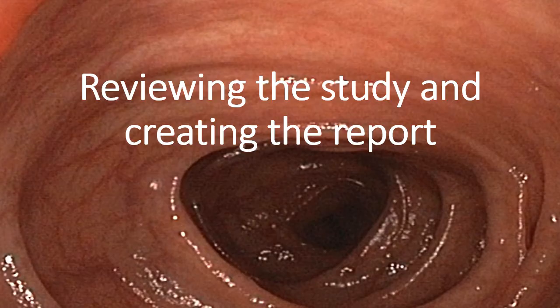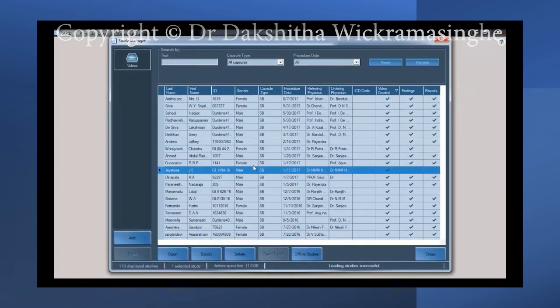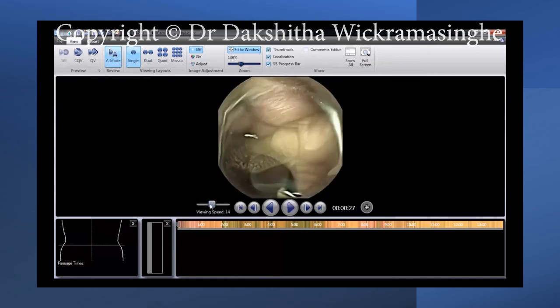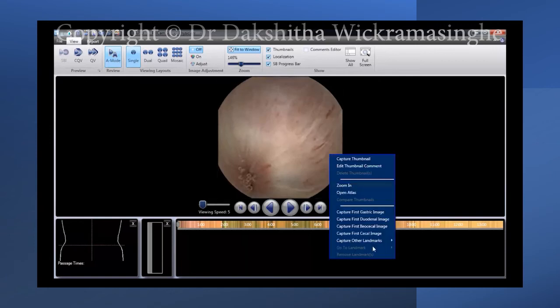Once the data have been downloaded into the software, you can review the study and create the report. Click on the view study button and then select study manager. This will open the database of patients. Select the study you want to assess and click the open button. One way of reviewing the study is by pressing the play button — you can adjust the play speed by moving the slider. Before beginning to report, set the landmarks to understand the anatomy better.